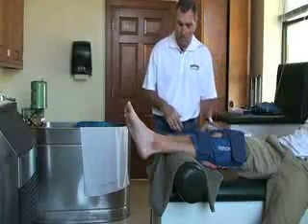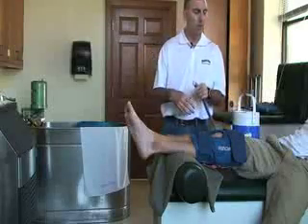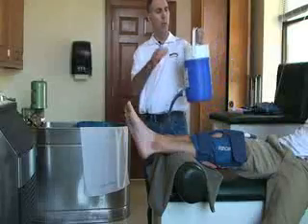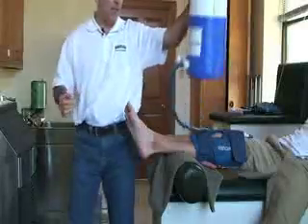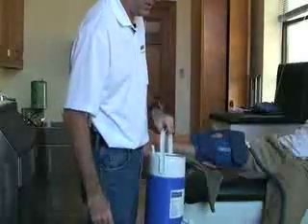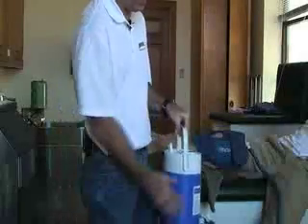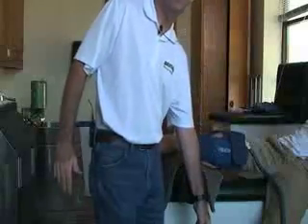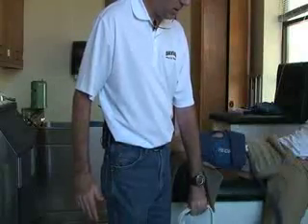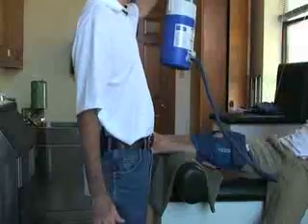At the end of 20 minutes — or if during treatment the patient tells you it's not cold enough — you can reattach it. Open the air vent and lower the bucket below the body part so that the warm water flows back down from the attachment into the cooler. Shake it up, then raise the bucket back up above so the cold water flows back into the attachment. Repeat this until the 20-minute treatment is over.